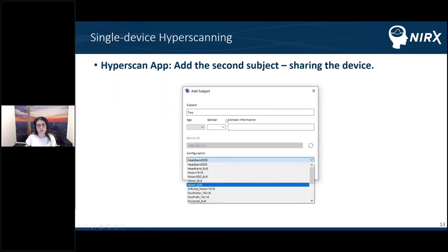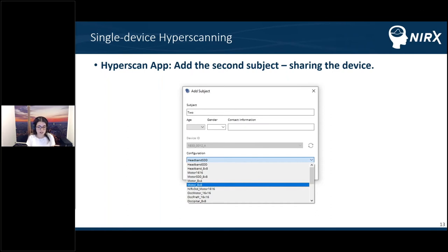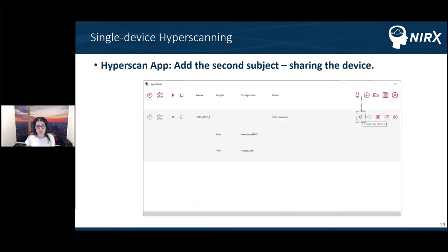Instead of adding a second device as in previous Aurora versions, I want to add a second subject to this same device using the 'add subject' button that belongs to the first device. After pressing that, the same dialogue appears — the only difference is that the device ID field is grayed out because you want to use the same device for this subject. The configuration can be completely different, so you don't need to use the exact same montage for both subjects. Now I have my Hyperscan setup ready: one device, two subjects.